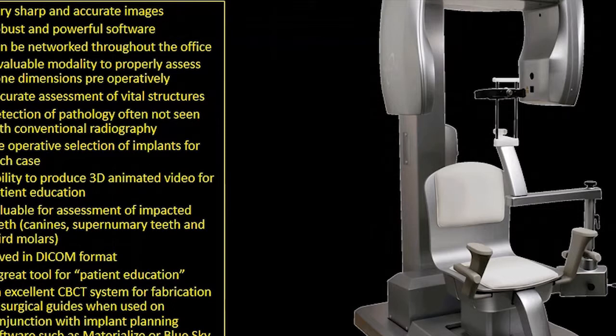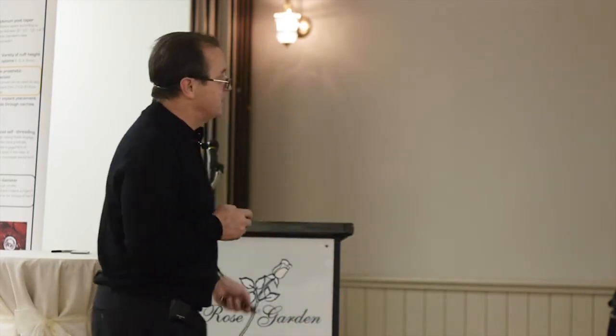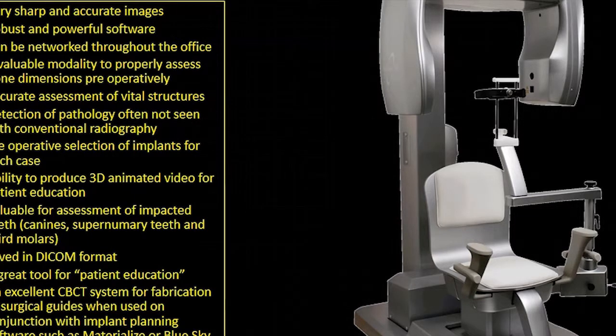It's great for assessing bone dimensions, accurate assessment of your vital structures, detecting pathology that a lot of times is not seen with conventional radiography. I mean, the number of cases where this tooth is really bothering me, I think I maybe see something on the x-ray, not real sure, take a CT, big old lesion, and it just doesn't show up in 2D radiography. Preoperative selection of implants for every case.